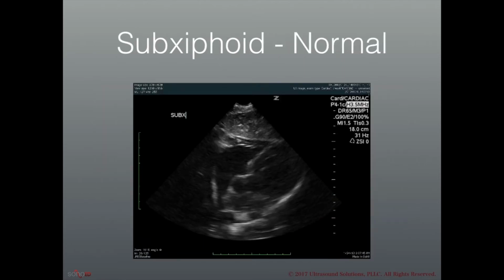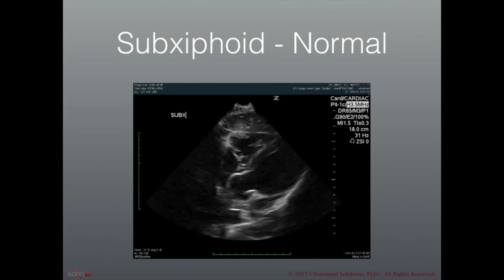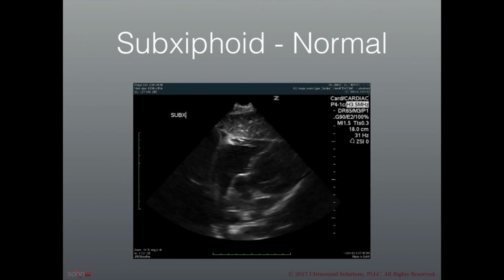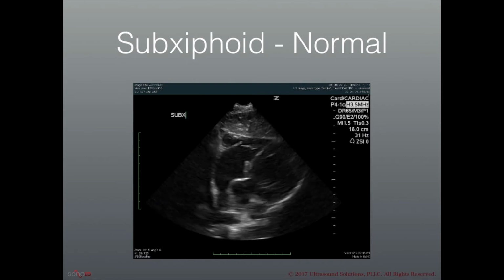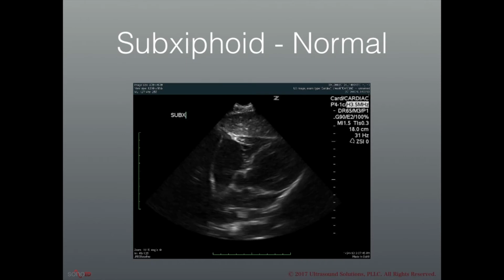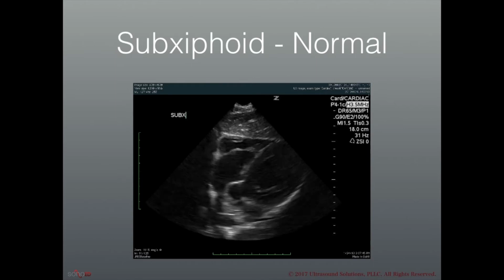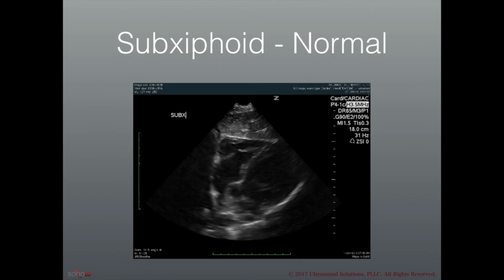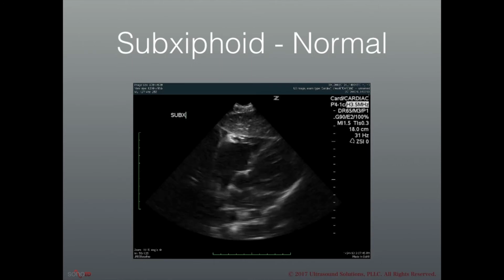Here again is a fairly normal view of a heart in the subxiphoid view. Looking at those three things that we talked about earlier that we want to assess for. First, we look at the sac or pericardium. Note here that in the upper left-hand corner of the image, just above the diaphragm, adjacent to the right ventricle, there is a tiny triangle of fluid that is probably just physiologic, but that is a bit of fluid in the pericardium.